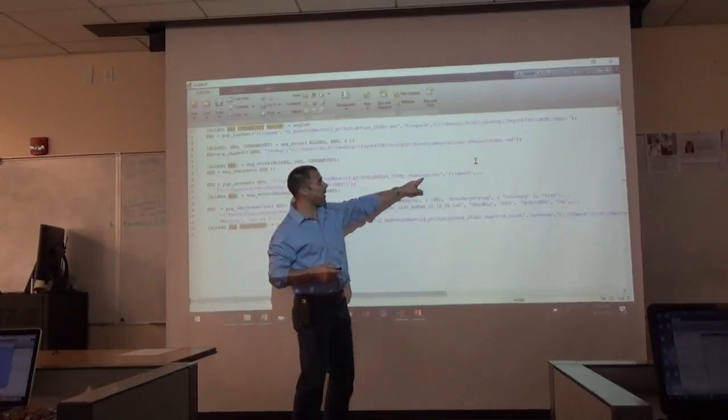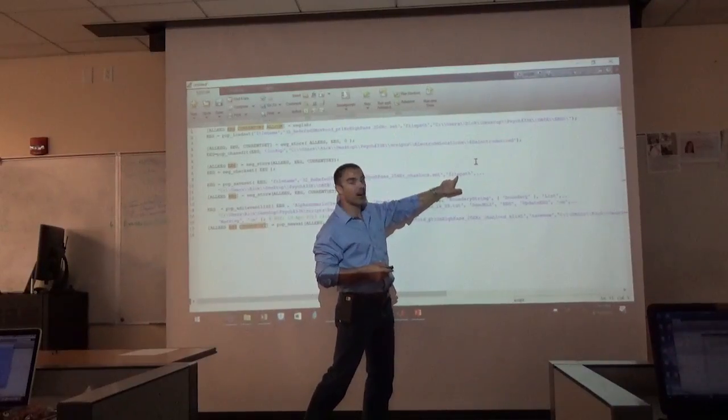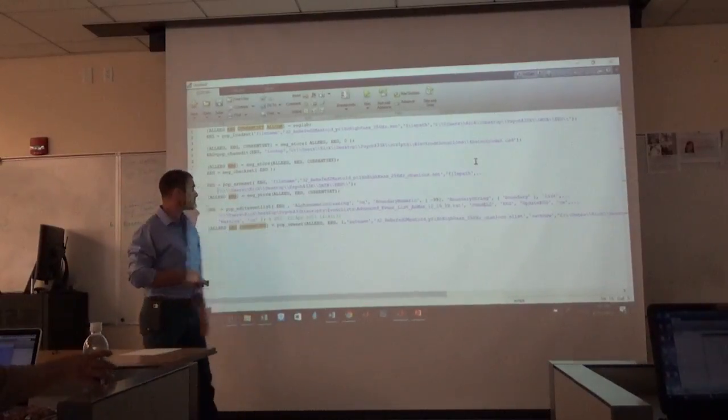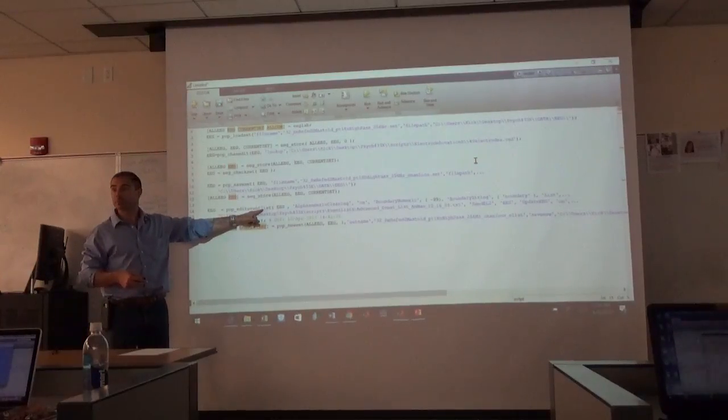So save, set. It asks us what name you want to give it. So we added this name, and then it asks us what path you want to put the file in, what folder you want to save it in. And there's our folder we saved it in. And then we edited our event list, right?